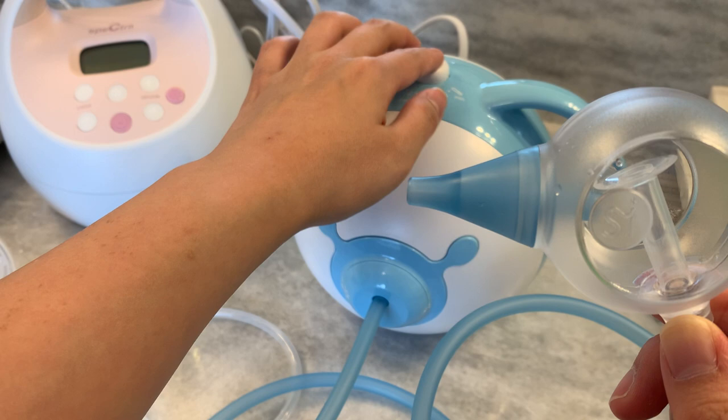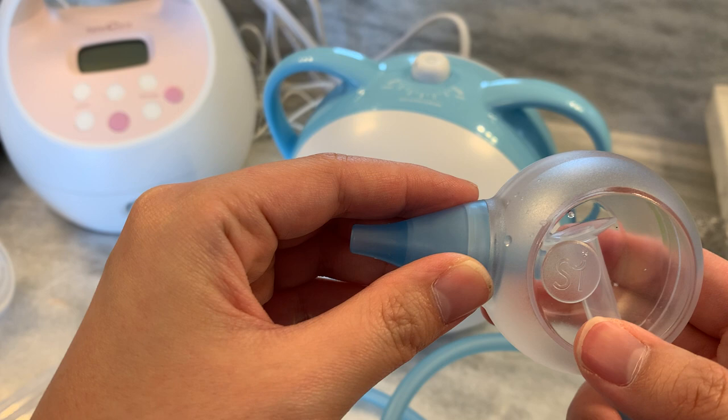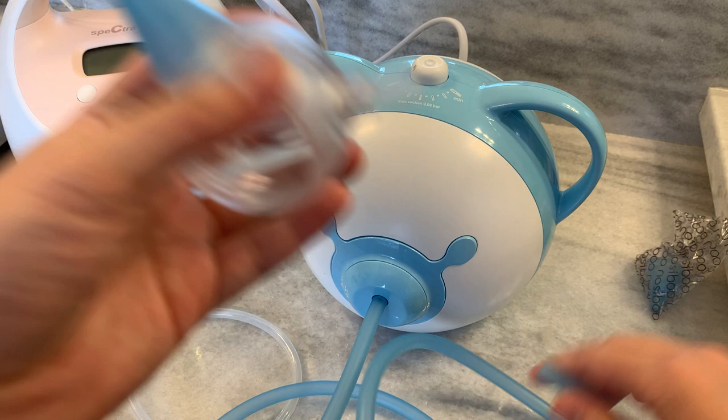The sound is super scary, but seriously, it doesn't matter what sound it makes — the minute anything is near my baby's nose, they're going to fight you regardless. Assembly is pretty straightforward and cleaning is also straightforward: you just disconnect this part, everything else disassembles, and you clean it up.